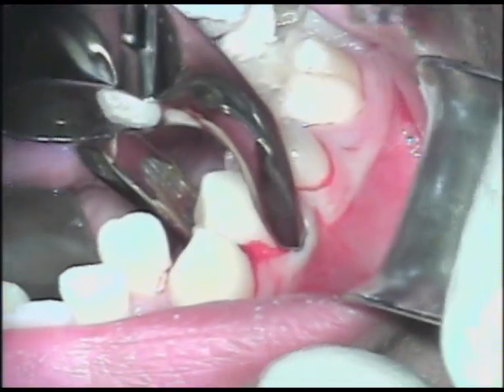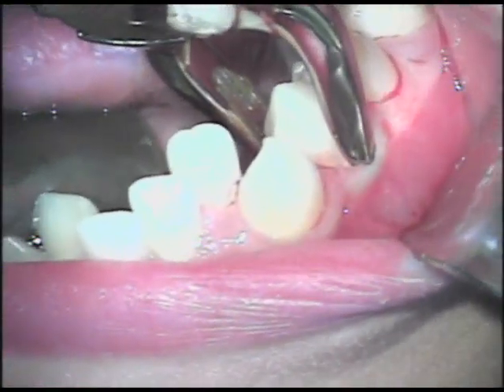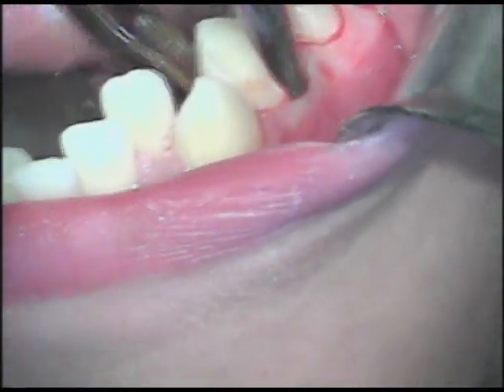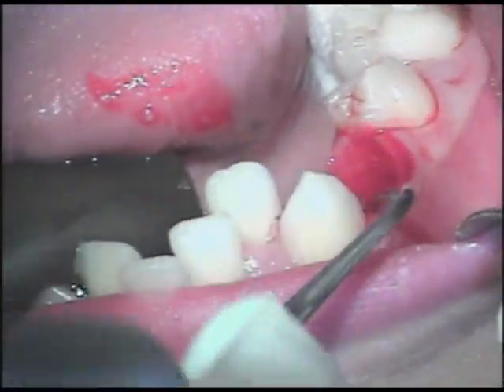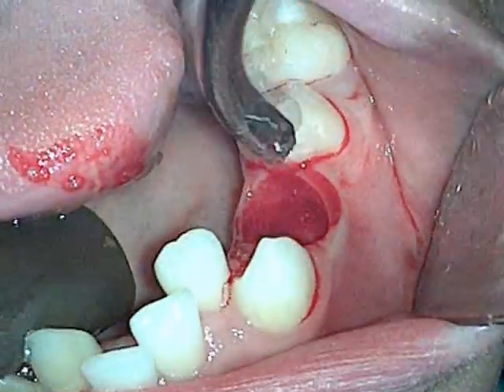And I'm going to come back again with the same upper universal apical retention forcep, and I'm going to do the same rocking motion to the buccal and lingual. Also, because of a fairly conical root, I can also give some rotational movement, and you see that the root comes out intact. Again, then curette out that socket, and then irrigate out the socket thoroughly.